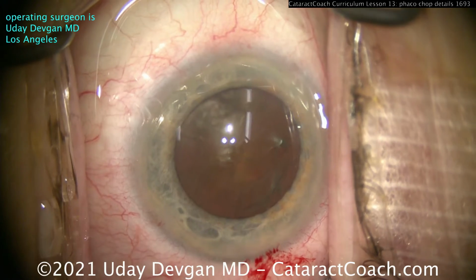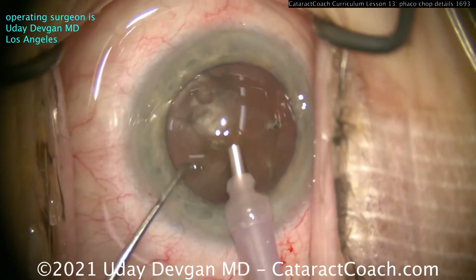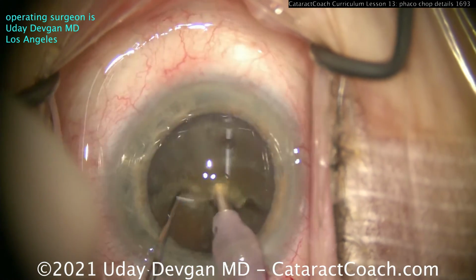So chop mode, high flow, high vacuum. At least flow for me is 40 cc's a minute. Vacuum is going to be 400 to 500 millimeters of mercury. Infusion pressure of at least 80 millimeters. Buzz in there. Chopper goes around. Boom. There's the 2 halves.